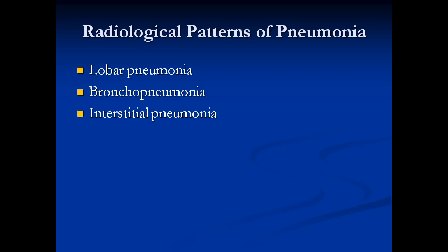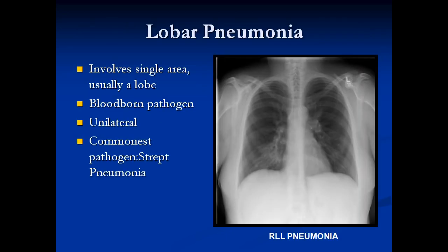Now the last topic I'm going to touch on is the radiographic patterns of pneumonia we see in the lung. Basically, there are three different patterns of infection of the lung: a lobar pneumonia pattern, a bronchopneumonia pattern, and an interstitial pneumonia pattern. All three are distinct and caused by different agents — something you want to remember when looking at a chest x-ray. Lobar pneumonias usually involve one single area of a lobe; the rest of the lung is normal. In this particular case, there's a right lower lobe pneumonia — an area of consolidation with an air bronchogram. Lobar pneumonias are usually caused by a blood-borne pathogen that goes to one area of the lung and spreads from there. It's almost always unilateral, and the commonest pathogen is Strep pneumoniae.